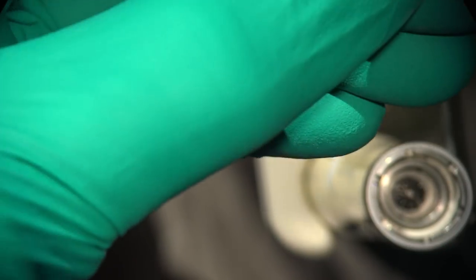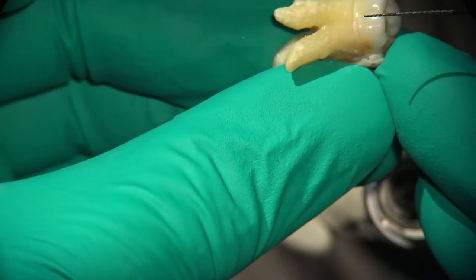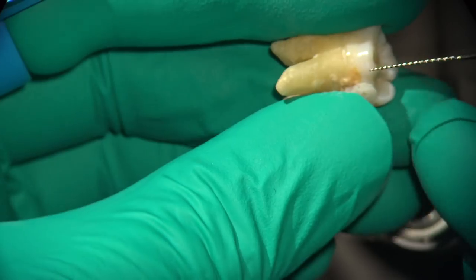One of the things, Ali, that people have to understand is that with the Scouts, there's a very small, tiny radial land. And what's the benefit of that? What the radial lands do is they essentially help center the file. So they give the practitioner a little bit of control over the tip. So Annie, let's try to take this 25 Scout, which has that modified landed design and actually get past the end of the root on this tooth.